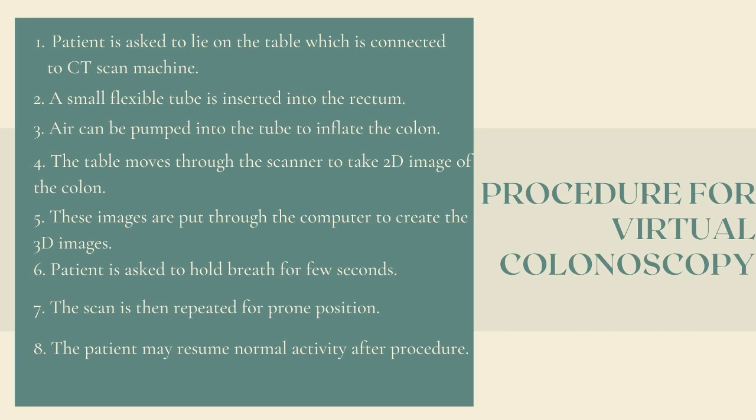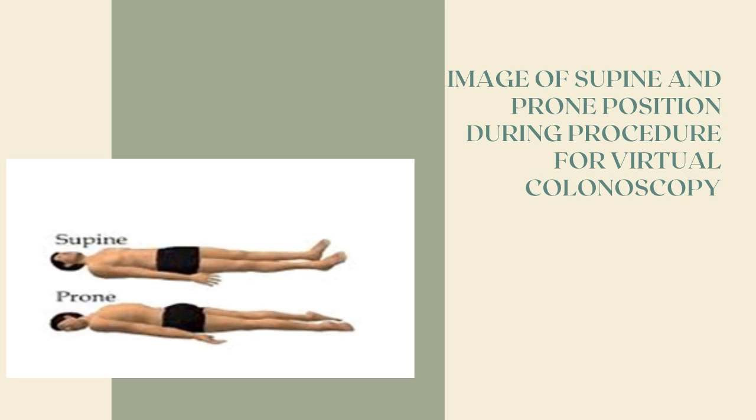After the examination, the images produced by the scanner must be processed into a 3D image. The patient may resume normal activity after the procedure. There is no post-procedure problem. These are the steps taken during virtual colonoscopy. This is the image of supine and prone position.